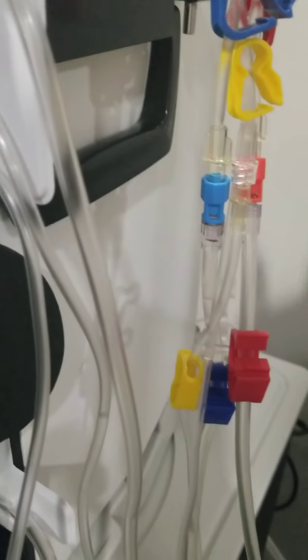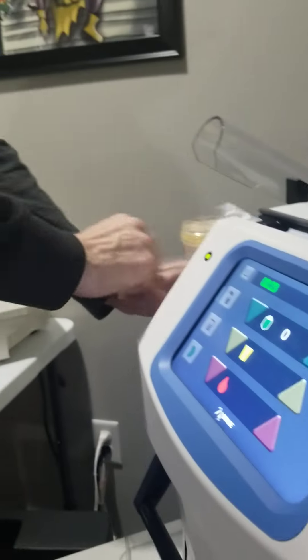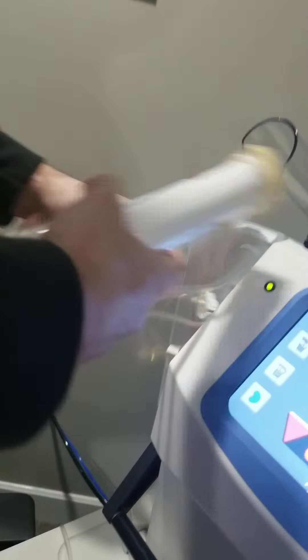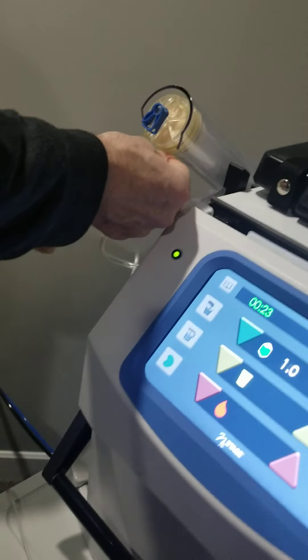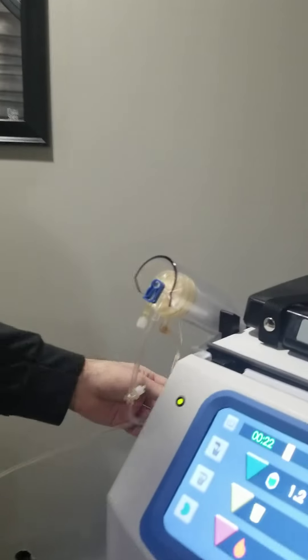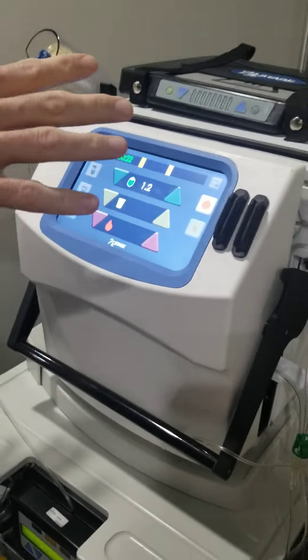I hit prime on the machine and it goes through the process automatically — it takes 23 minutes to prime. It automatically draws the saline solution into the tubes and removes all the air. I also have to set up the dialyzer filter. This comes all taped up — I undo these lines, slide it in place, and clamp off a couple of clamps because if you don't, it tends to leak during this process. So that's ready to go machine-wise. Again, it takes about 20 minutes to complete that prime.